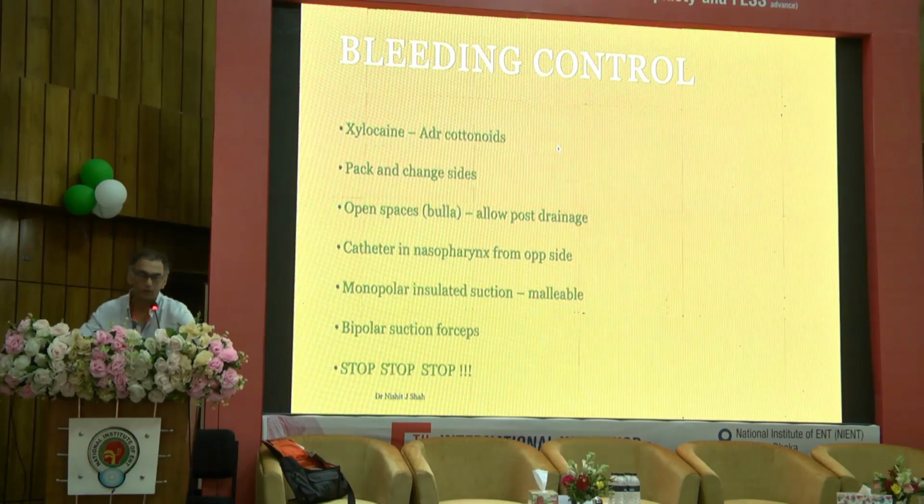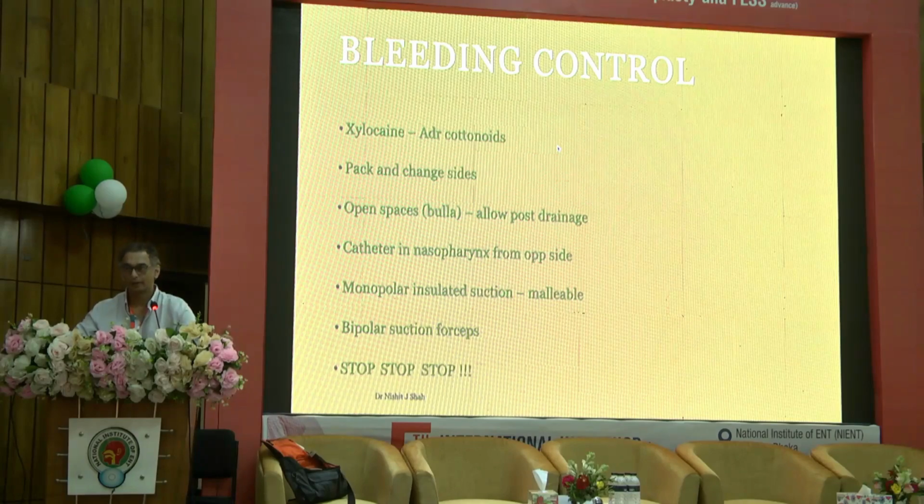You're going to use adrenaline-soaked patties. And again, a word of warning, I know there are people who want to use pure adrenaline, okay? And you have seen some experts talk to you about the use of pure adrenaline. Please understand there is a difference when an expert operates and when a beginner operates. When an expert operates, there is minimal mucosal trauma. And so when he's using pure adrenaline, there is minimal absorption. When a beginner operates, there's a lot of mucosal trauma. And now when you try and use pure adrenaline, there's a lot more absorption. Okay, so for everyone, unless or until you become an expert, use it diluted.